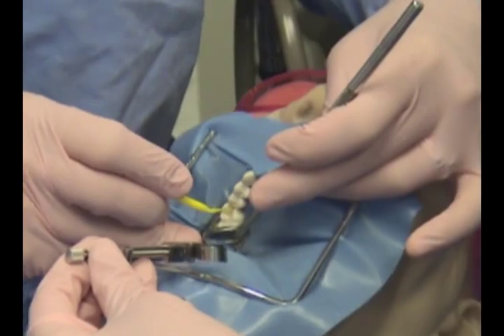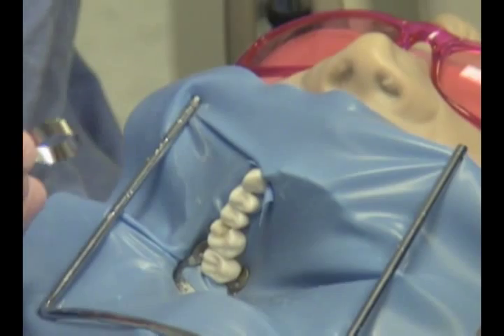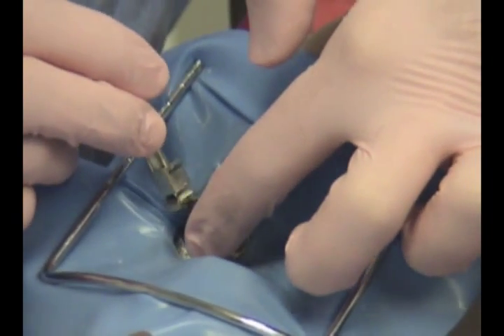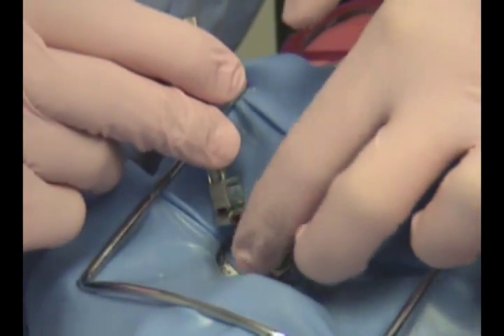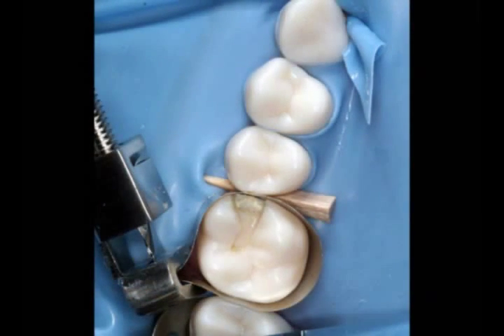Once the Copalite is placed into the preparation, a matrix band may be placed around the tooth. Matrix bands are only used in class 2 preparations. Since we are working on the mesial surface of tooth number 3, an MO restoration will be placed. The MO represents a class 2 restoration. Once the matrix band is placed, a wedge will then be placed. The wedge is placed to help prevent any overhang and keeps the matrix band in contact with the side of the tooth.